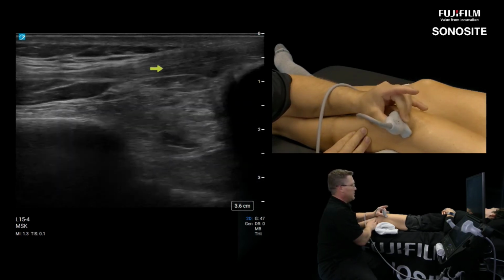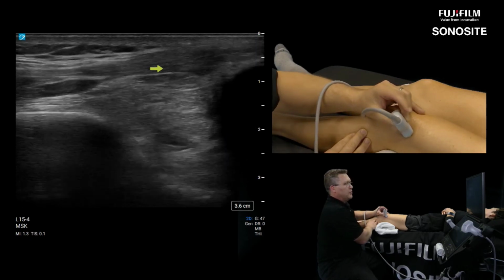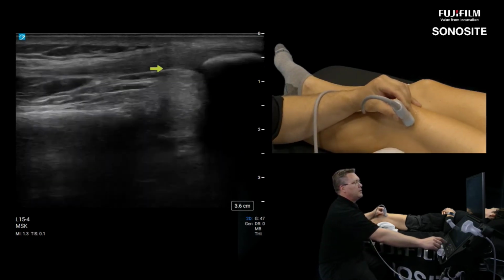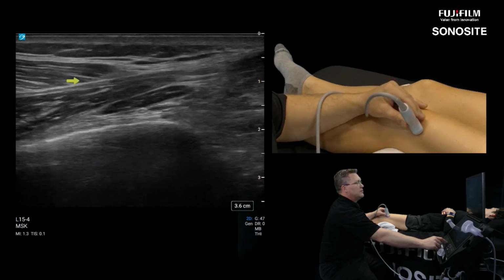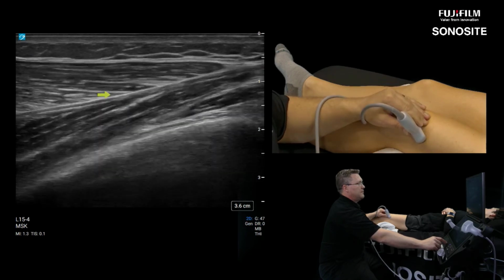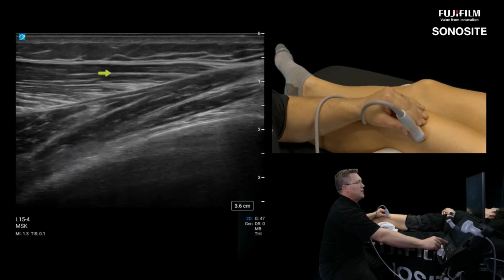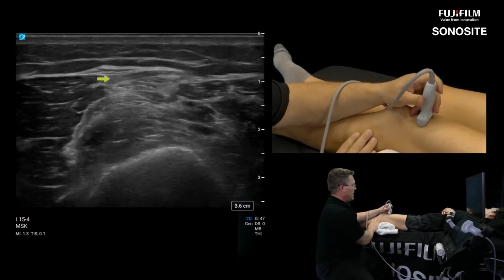But you can see my transducer plane and how lateral it is, upward sloping towards the patella. Here we go. Here's the vastus lateralis, and you can see its central tendon and its bipinnate, feather-looking, classic muscular architecture here.